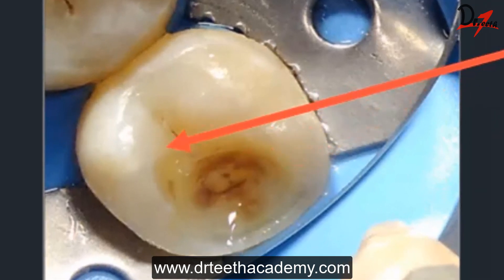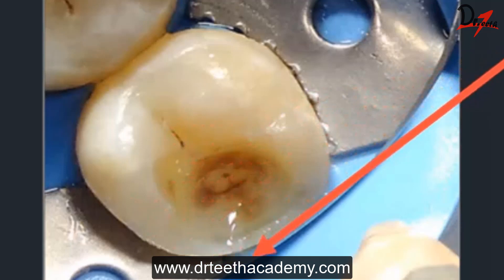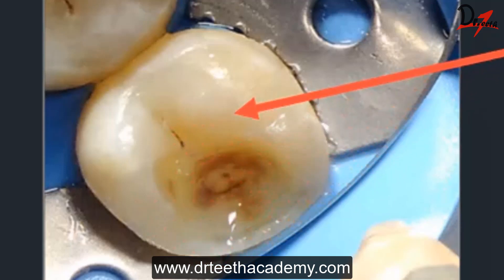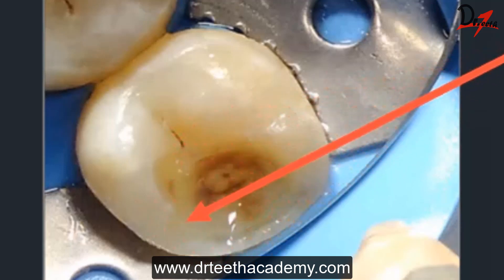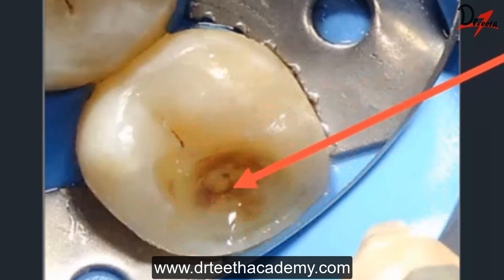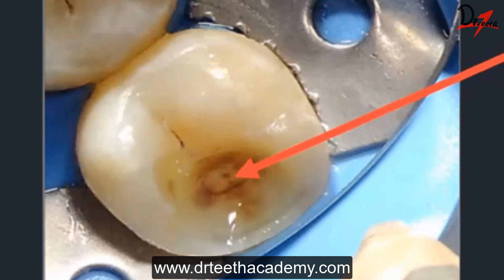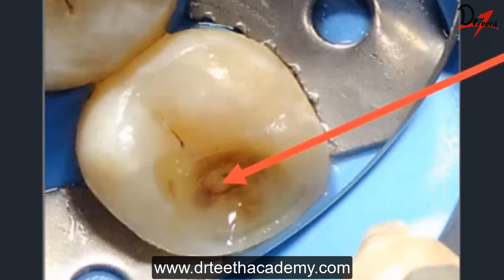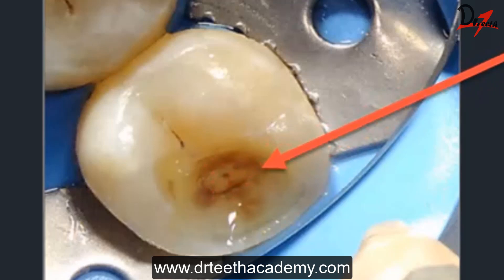I have completed everything along the periphery. When it comes to dentin, I left some amount of discolored dentin which was hard but not carious — as we usually do in such cases.